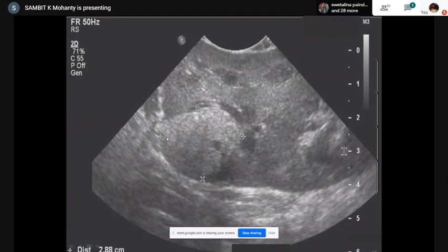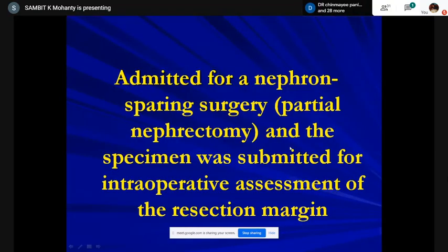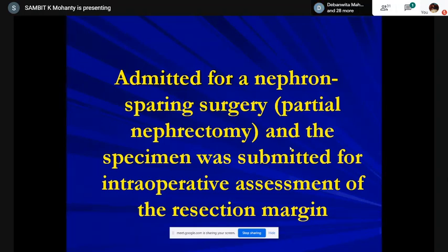The mass was hyperechoic, vascular, and well-circumscribed on ultrasound — shown here with the four stars or 'X' sign, with some vascularity in the black area surrounded by vessels. Pretty well-circumscribed. The patient was admitted; since the mass was in one of the poles and small, and the patient was young, the urologist opted for nephron-sparing surgery.